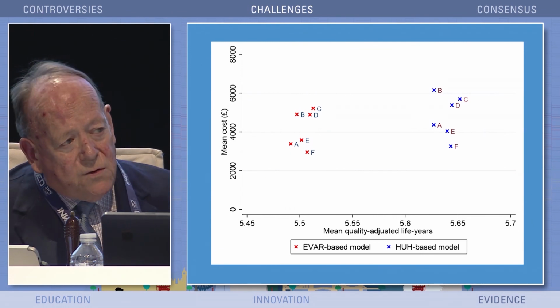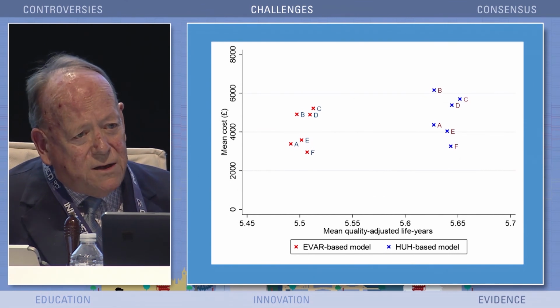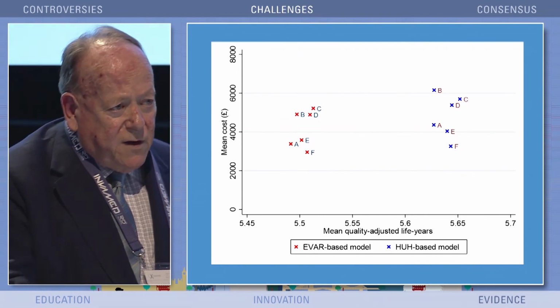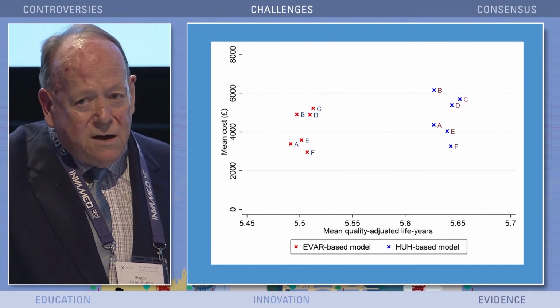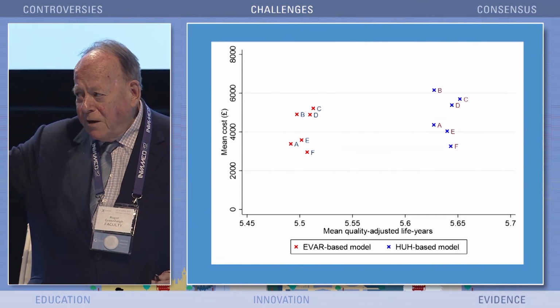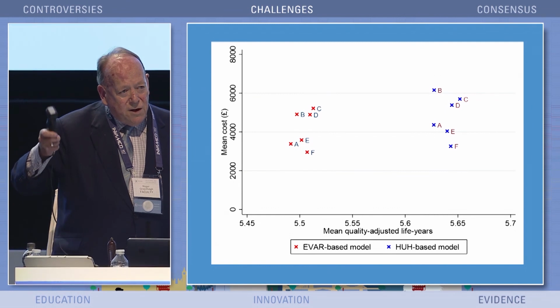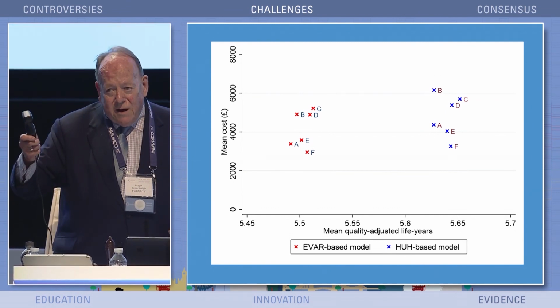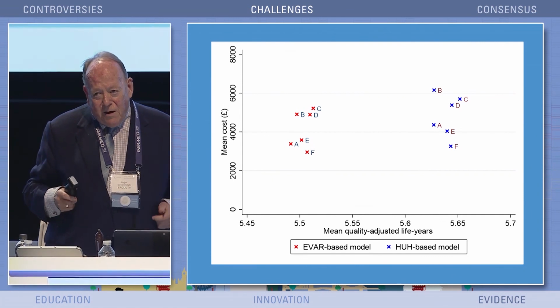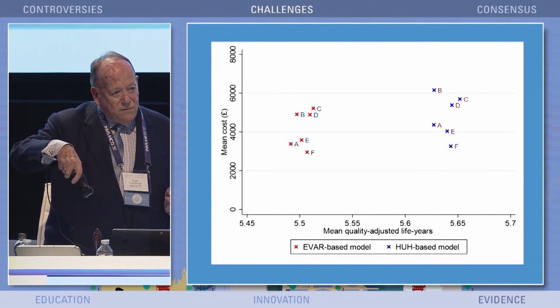And I've listened to all of the caveats of the scientists, but as a mere clinician, I'm going to go beyond that. I'm going to show you the device that's going to revolutionize endovascular repair. This is a probe by Butterfly. John Martin has brought it across from California. I'd heard about this. He's brought one. And this can work off a mobile phone, an iPhone, and it will be possible in the community to measure the diameter of the aorta.